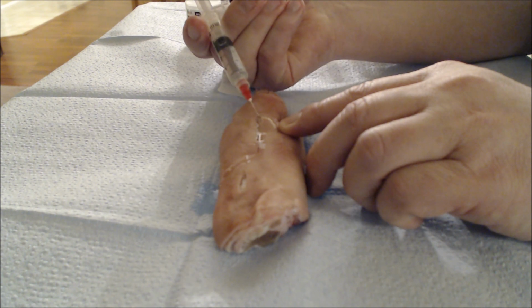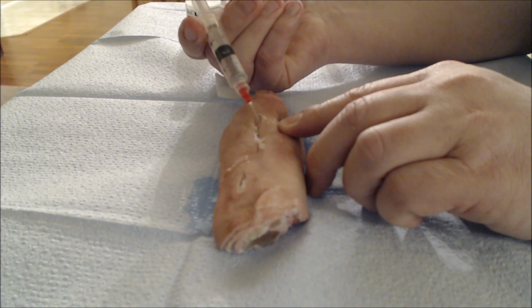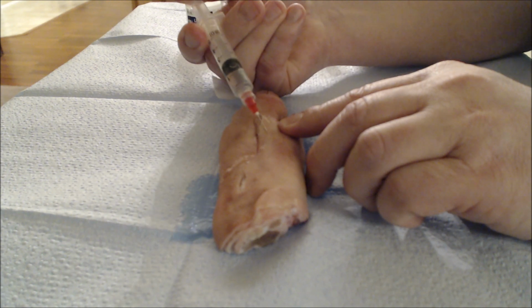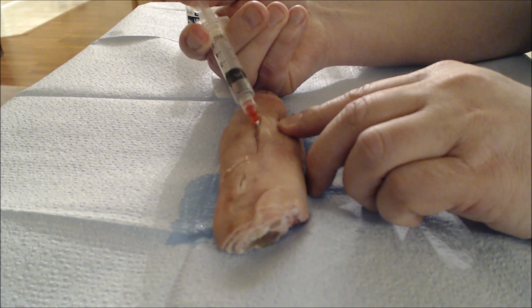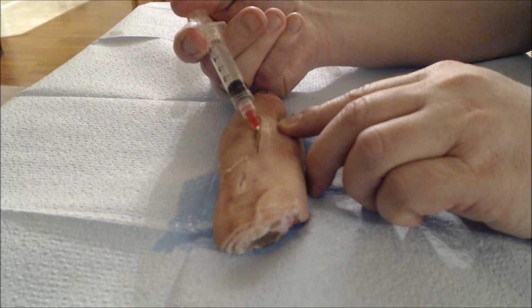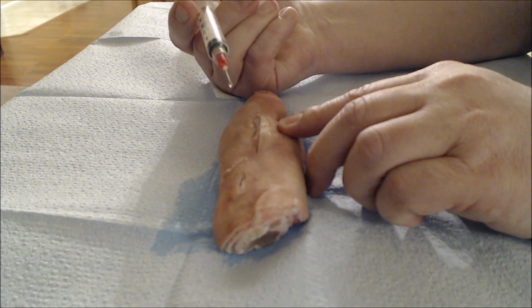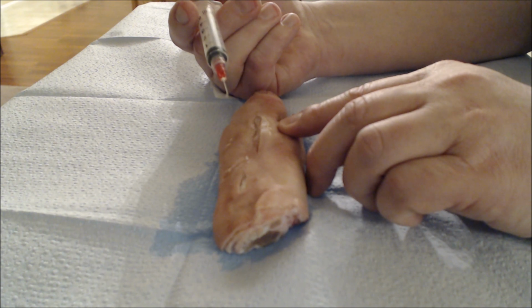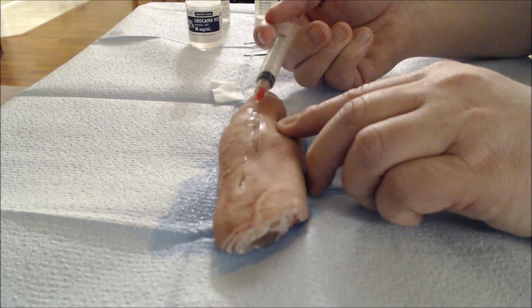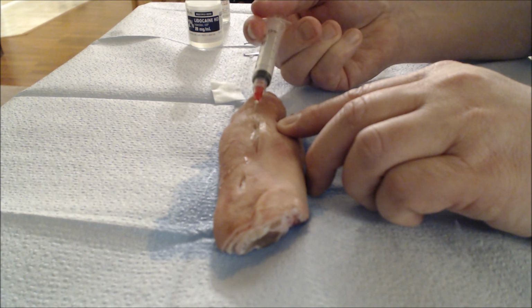If you inject that this way and then march forward, you can see that you will only be placing the needle inside areas that are already numbed up, and thus the person won't feel the needle stick but once. Do you see how it puffs up? Now, if you're using lidocaine with epinephrine, this entire area will become white because it's closed down the blood supply there. And that's how it helps stop the bleeding process from the skin edges. Next, we'll repeat the process on this side, marching up one after the other so that the patient does not feel but one injection.